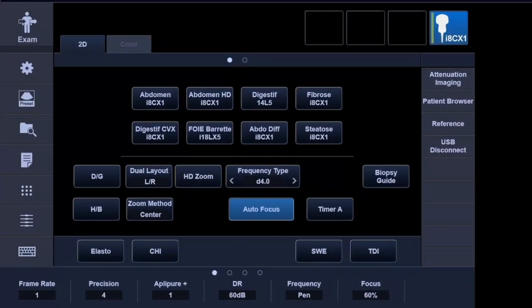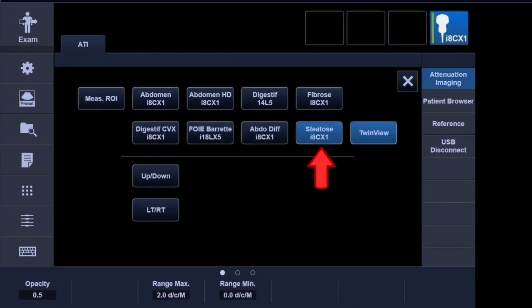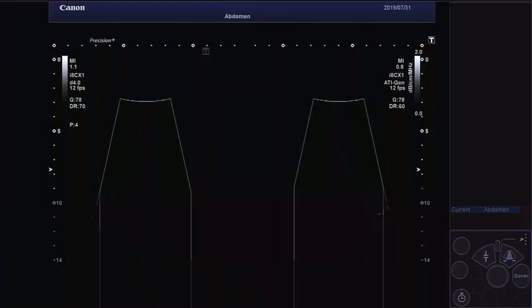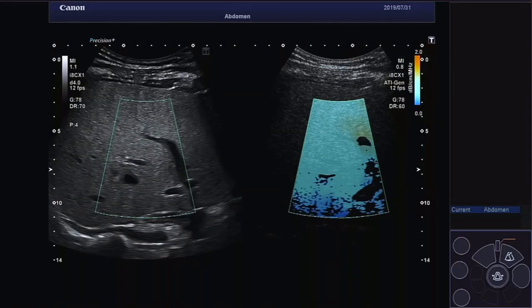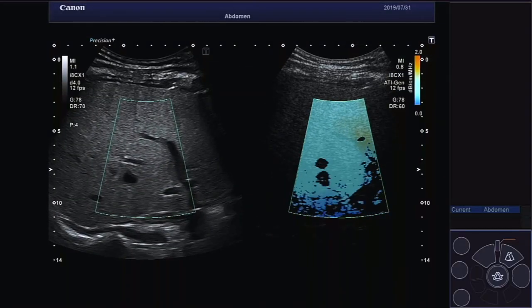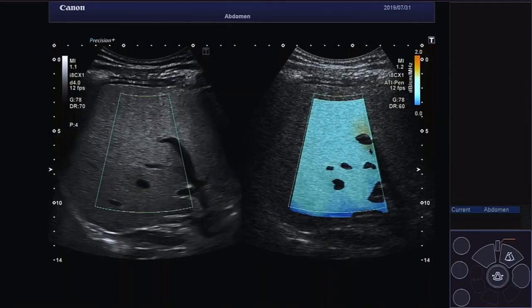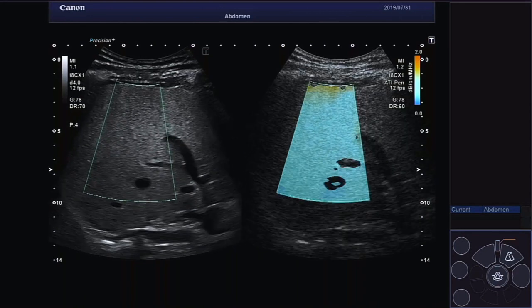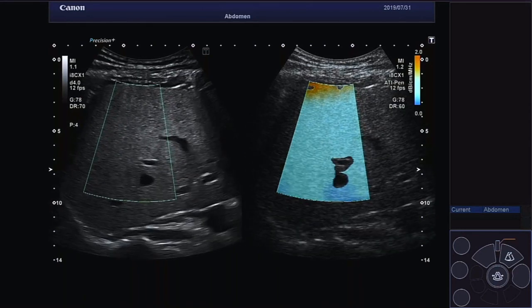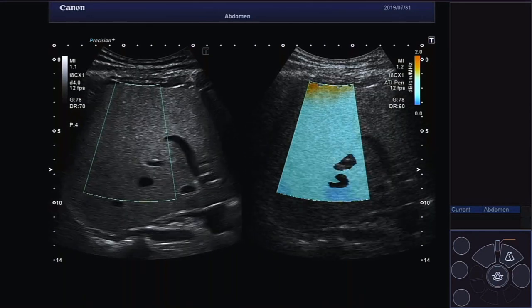First, activate the sub-preset steatosis for optimized settings. The image starts in dual mode with on the left the 2D reference image and on the right a color map displaying the different levels of attenuation.